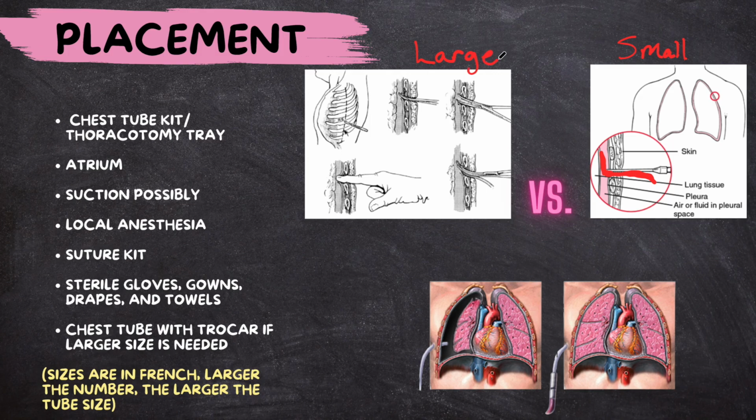Now, notice the difference here. They're making a cut here with a scalpel, and that cut just depends on the size of the tube. It can be, you know, 1.5 inches or better to make a slice in. Now in these sequential steps here, they're using forceps to go through their cuts, and notice how they're widening the forceps up. That's opening kind of that muscle and subcutaneous layer and kind of breaking through that area and making a hole.